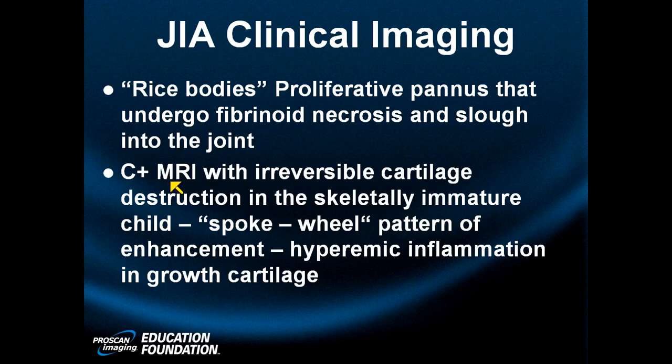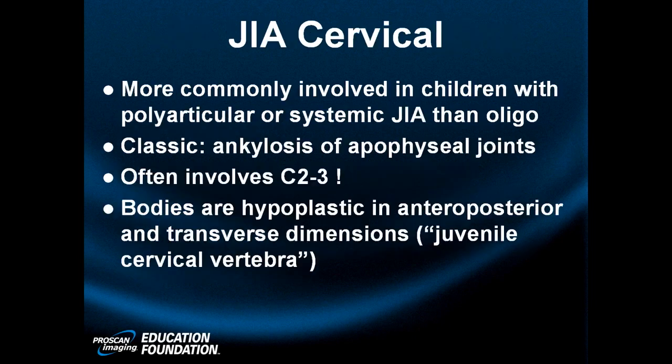If there's inflammation with gadolinium, it is said this is a sign of irreversible cartilage loss. I personally do not like to give gadolinium to children with small fields of view and good STIR imaging. I can do all the things I need to do without giving contrast, so personally, I do not give contrast for grading or staging, OMERACT system or otherwise, for JIA or any other arthritis. The spoke wheel pattern of enhancement has been described as evidence of hyperemia and cartilage destruction. Again, I don't use it.